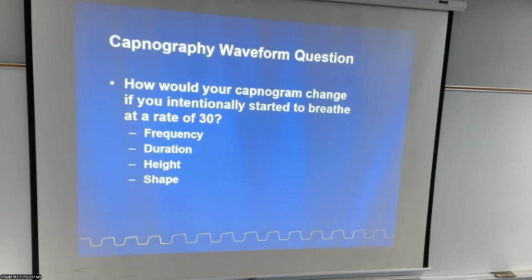Earlier you said that if it's a COPD patient or somebody with respiratory problems like that, it would be different. What would be normal for a COPD patient? COPD patients, most of them run on the oxygen drive. So your end-tidals may be slightly elevated into the 50 range, but anything up out of the 50 range, people can't do it.